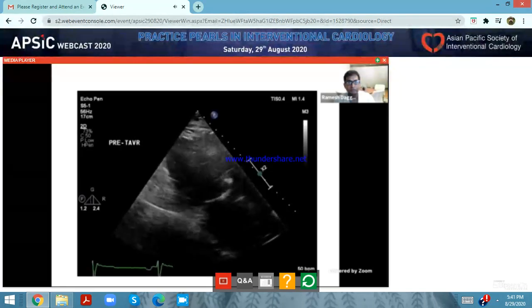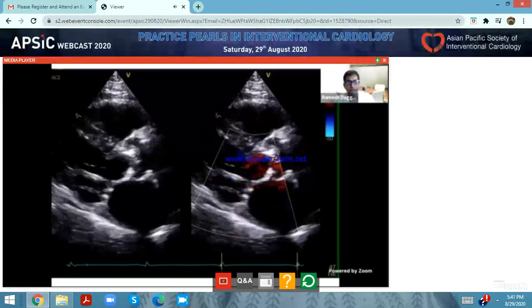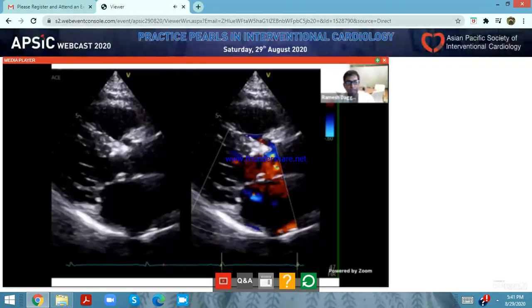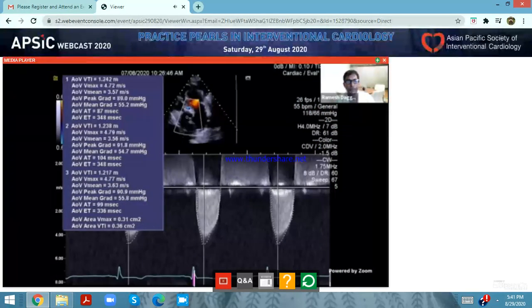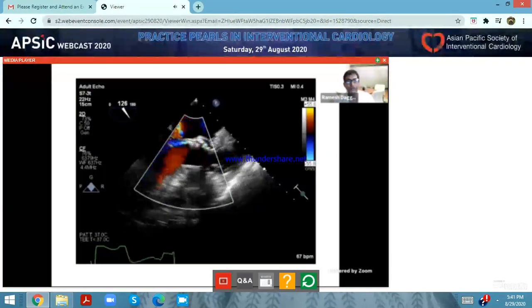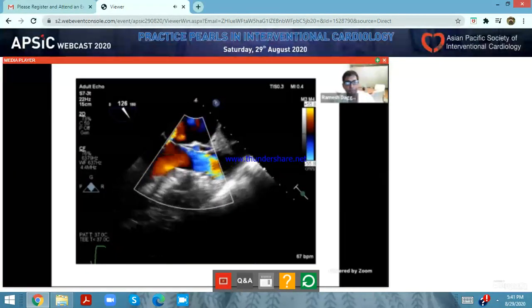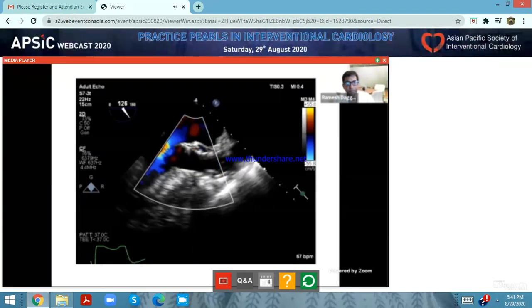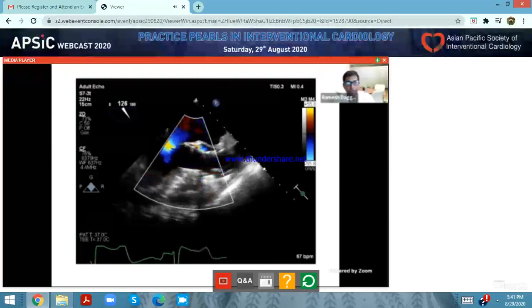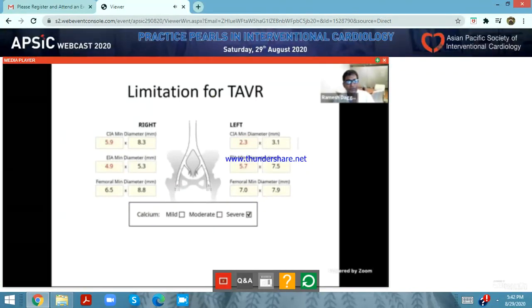And so we looked at the echocardiogram here. You can see heavily calcified aortic valve. There's some mild AI and MR, but a heavily calcified valve with mean gradients, as you can see, about 55 millimeters of mercury. So there's no doubt it's a severe AS. And so this is how we have done the TAVR. You can see a 34 millimeter TAVR was placed, and I'll show you the other slides. But with some paravalvular leak, which we again ballooned with the 24 Atlas balloon, and got an excellent result. But that was not the story for this patient.